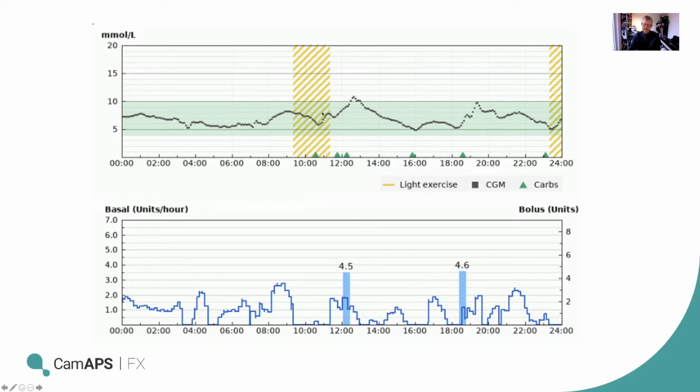I think we talked about 90 minutes before. I think I actually switched it on maybe half an hour before I started the activity, because I could see a sort of downward drop and knew that I was going to be moving faster than I expected. There was that sort of downward trend on the graph for an hour or so.